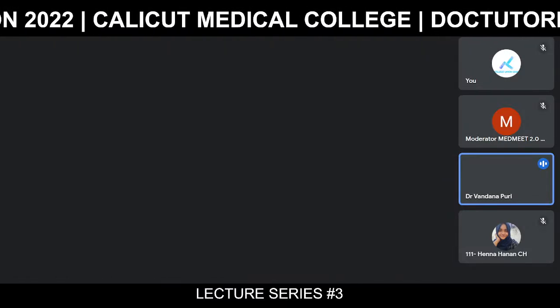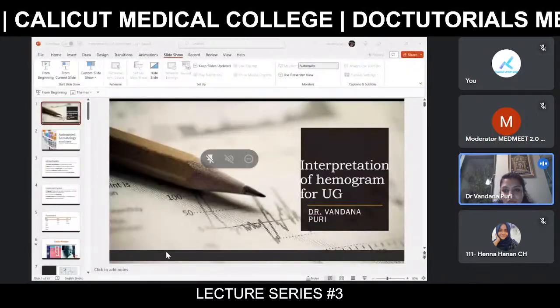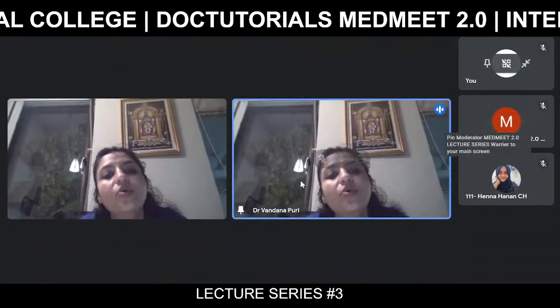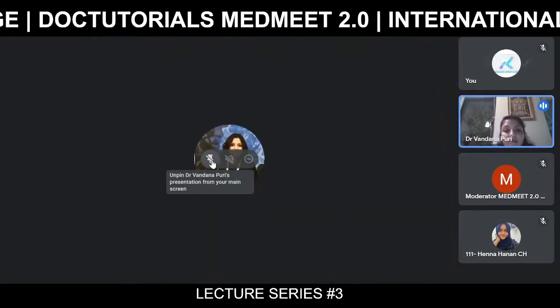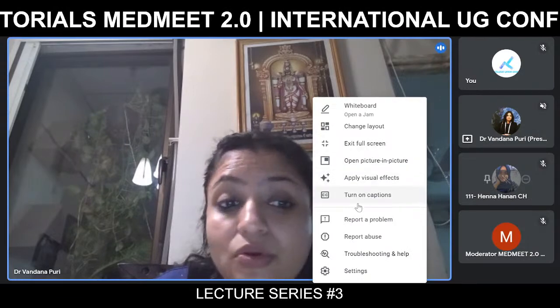And what are the disadvantages? Disadvantage means there is flagging which is going to occur. You know, machine is a machine. So when it is not able to identify something or distinguish between two cells, it will give you a flag. Flag always means you have to go and see your manual smears again. And it doesn't tell you about morphology. Obviously, the bread and butter of a pathologist is morphology. You have to see the slide, which your counters are not going to tell you.